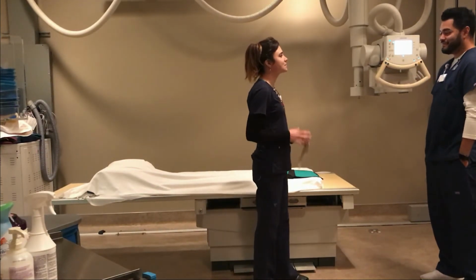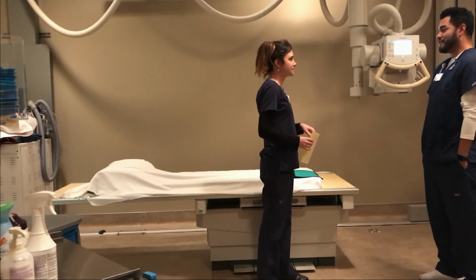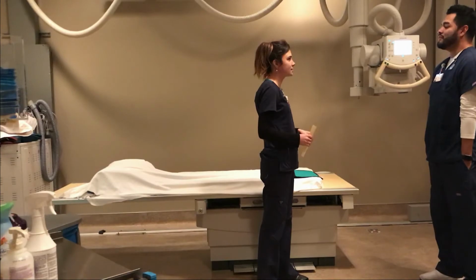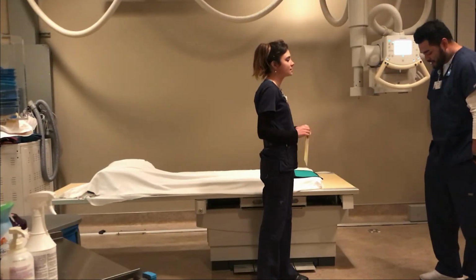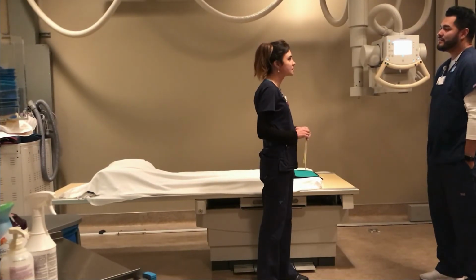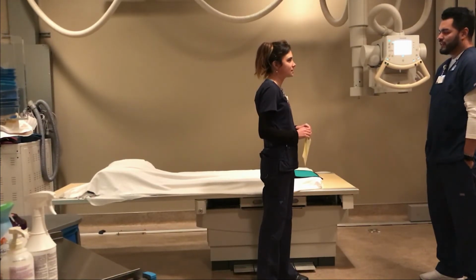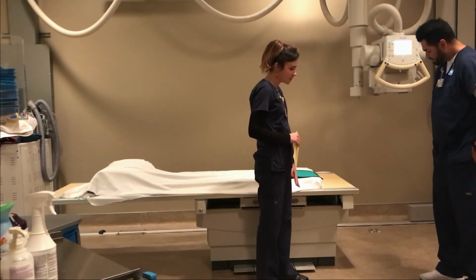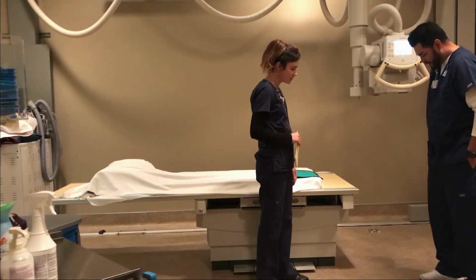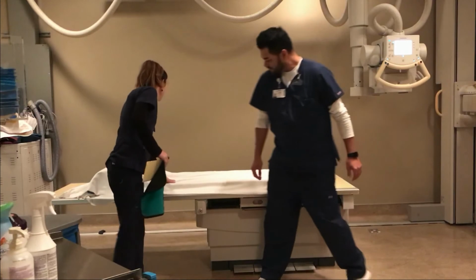Hello, hi, I'm Sky. I'm from the radiology department. Can I get your full first name and last name? Philip Lopez. And your date of birth? 5/24/87. Okay. And is there a chance that you're pregnant? Nope. Alrighty. And what brings you in today? I tripped and I fell and landed on my knee. Which knee is that? The right one. Okay. And how long ago was that? Two days ago. Okay. And do you have any buttons or any metal around your knee? Nope, I'm good. Alrighty. So I'm going to have you go ahead and lie down on the table with your back down.